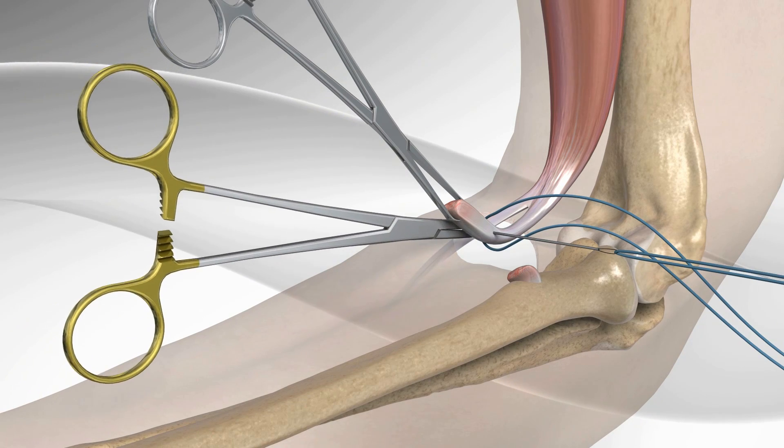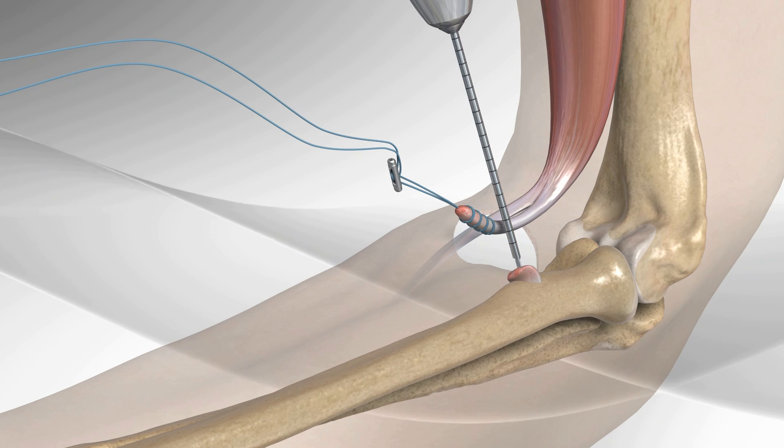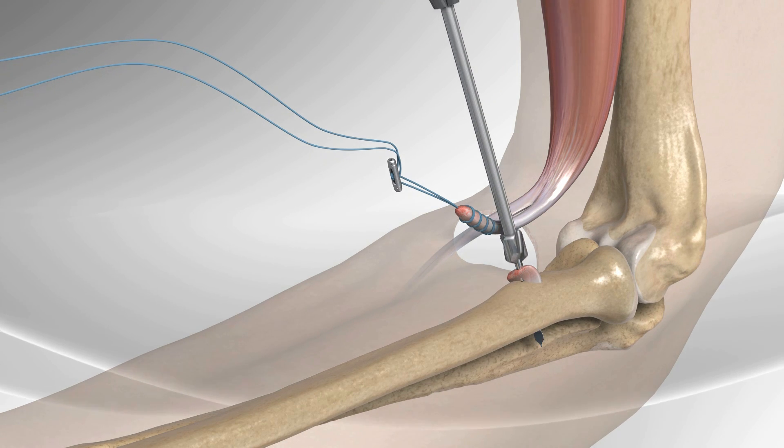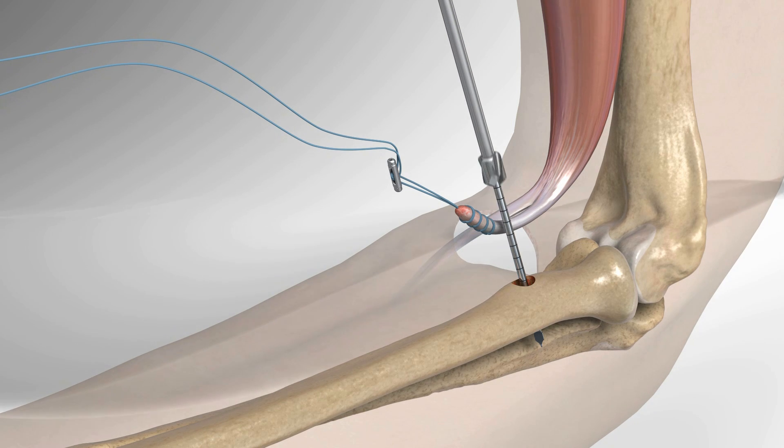The two strands of suture are passed through a metal button in a specific pattern. A guide pin is drilled through the natural attachment of the biceps tendon on the radius. Sliding over the guide pin, a socket is drilled in the radius.